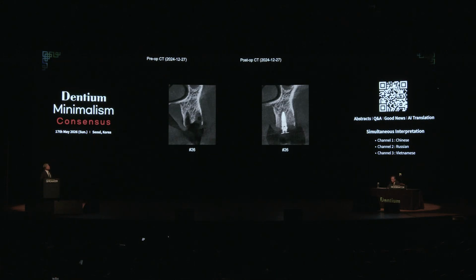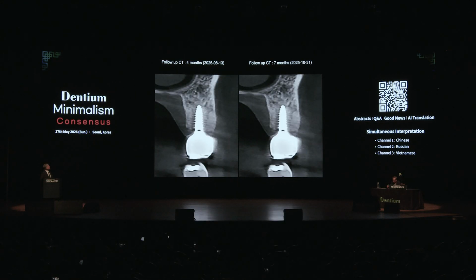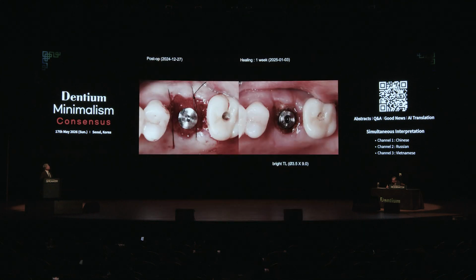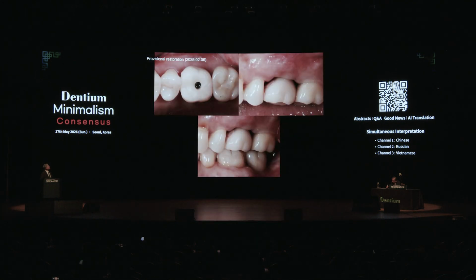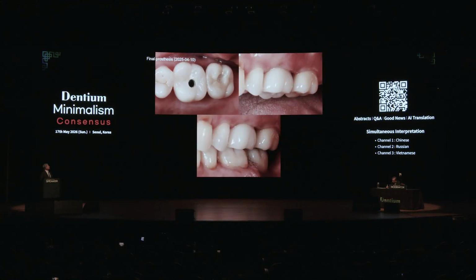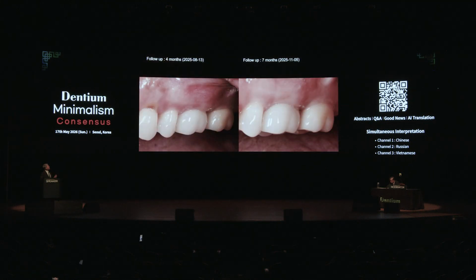After the extraction, we place the implant in the septal areas. After that, all very similar to the previous cases: very narrow diameter, the septum, the implantation, and the collagen graft healing, and through the temporary crown we proceed to the final processes. With some effectiveness of the collagen graft, the distal side, the interproximal spaces can be filled with the soft tissues.